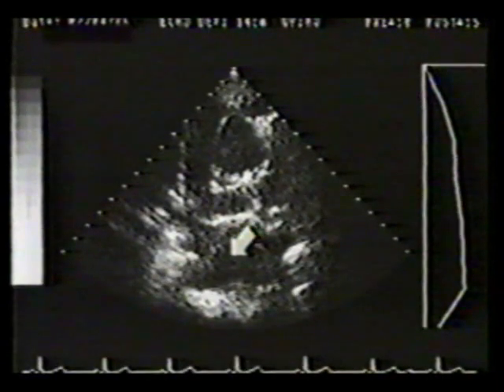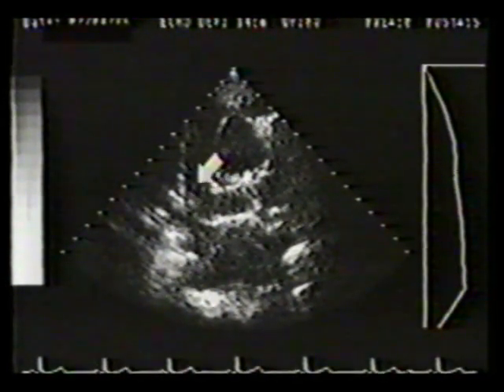The left atrium is below the right pulmonary artery, and in this view, the ostia of the pulmonary veins can often be identified. Right superior, left superior, left inferior, and right inferior. The superior vena cava is seen in long axis here, beside the arch.